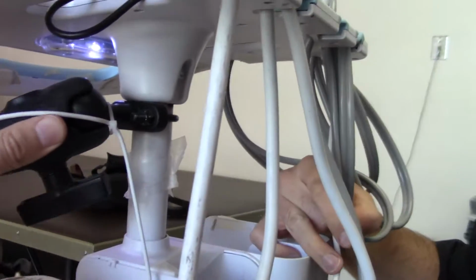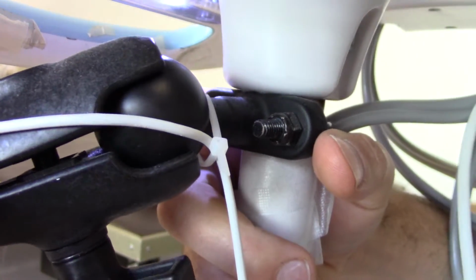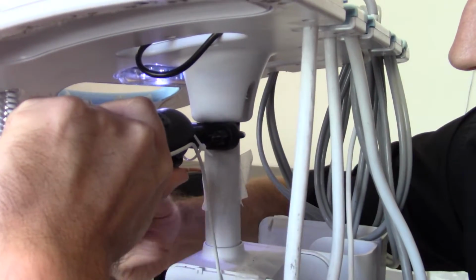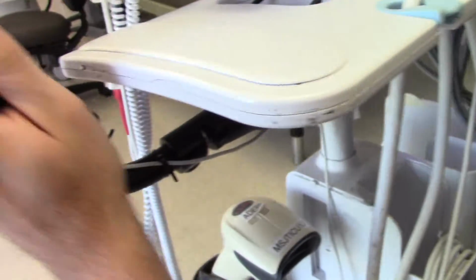So this little mounting ball here. Oh, look at that. The cables are short there, but you can see this ball unit. It just clamps on here, and that's the basis of how this works, like a shoulder. It lets it rotate. Correct. It's just a ball and socket joint. All these parts are some sort of nylon. So that's the joint. Then you've got the pipe in between them.